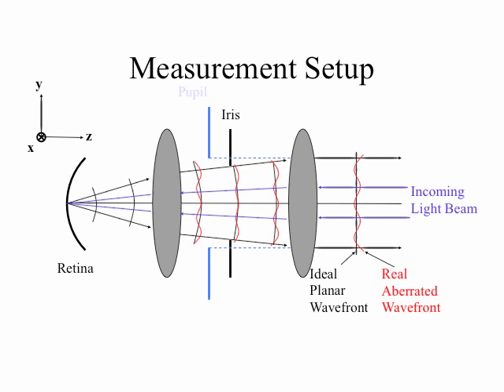Anyway, the photons come off of the retina, they form this perfectly shaped section of a sphere, and they encounter the patient's lens, and the lens has a plus power, and these are diverging rays of light. In terms of the vergence, they represent this convex wavefront that's coming off of the retina, and they strike this plus lens, and the plus lens makes them less divergent, but incompletely so. So they come off of the lens, and they're still diverging slightly. The wavefront is still a bit concave, and then they come out of the cornea, and if this is an emmetropic eye, then they're going to come out of the cornea with a planar wavefront.